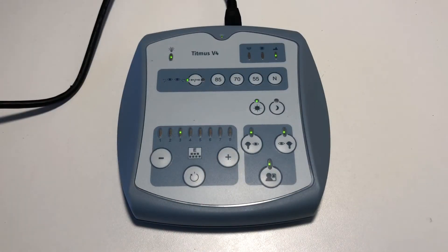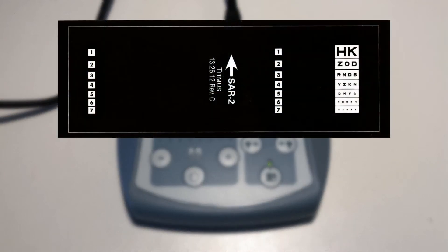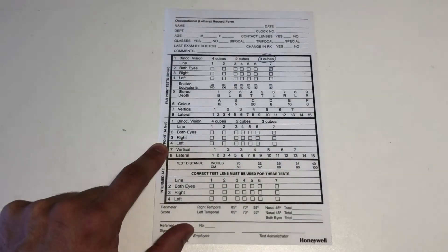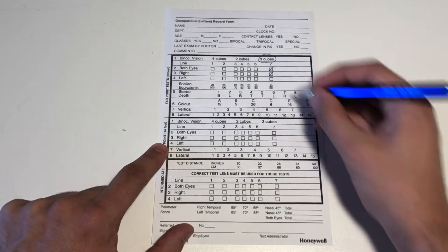Advance the slide to number three. This slide tests for visual acuity in the right eye. The procedure is the same as for slide two. Mark the results in the right answer box under far test.